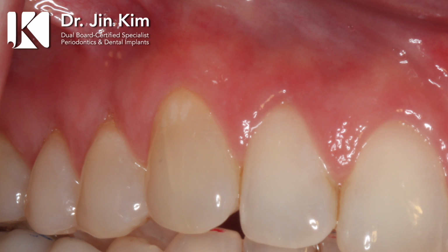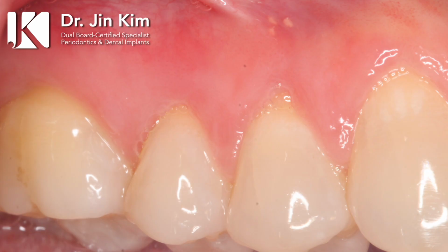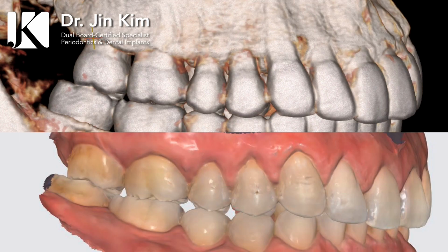So this is the area of interest where we see practically all the teeth in this view have a degree of recession, the gum missing, and therefore the roots being exposed. But when the roots are exposed, it really means that the bone is damaged underneath. And again, some severe root exposure in these teeth in the image. So here is the side-by-side view of the bottom image, which is the intraoral scan.